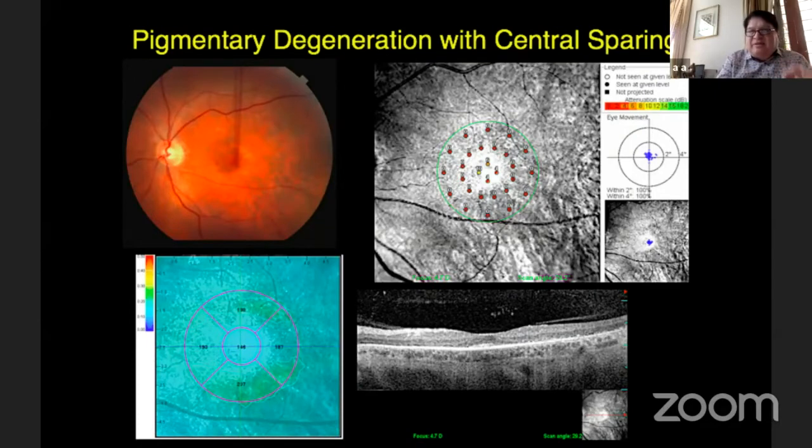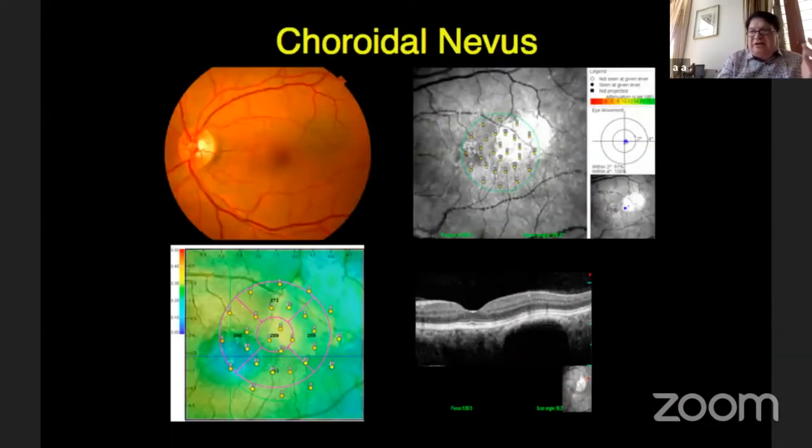He still has some vision, a spark of vision there. And the patient, I really made their parents very happy. And probably this is one thing which I have used and I have found it to be good. You have lesions like a choroidal nevus. You want to know whether this nevus is going to increase, whether you need to do something. And you can know this exactly by calculating the changes in the microperimetric value.